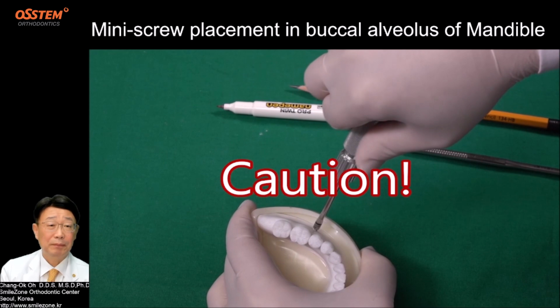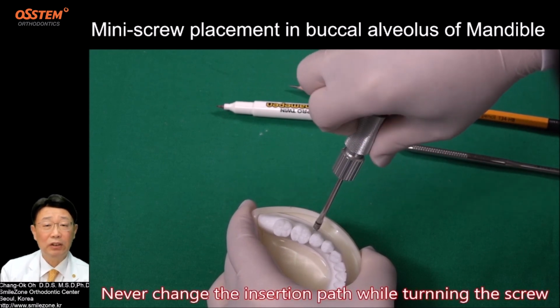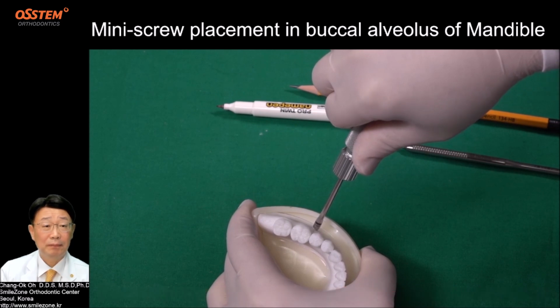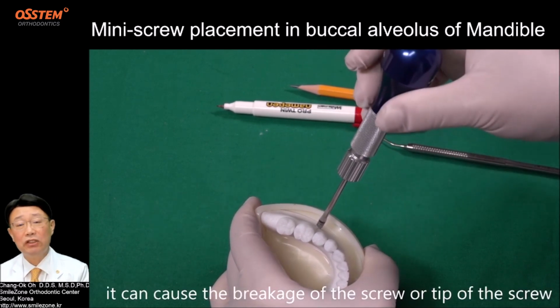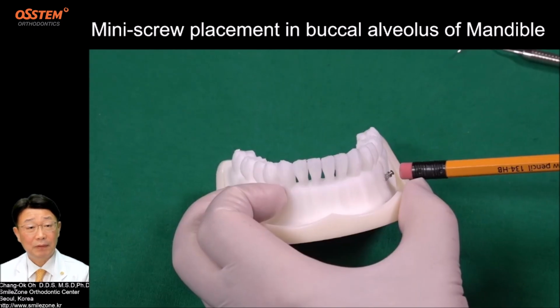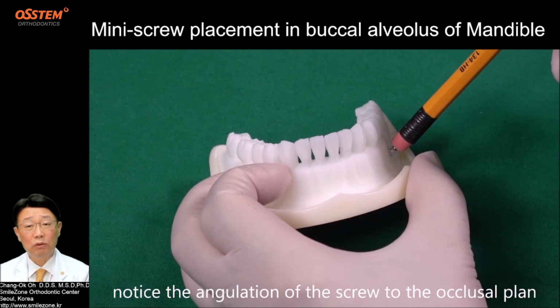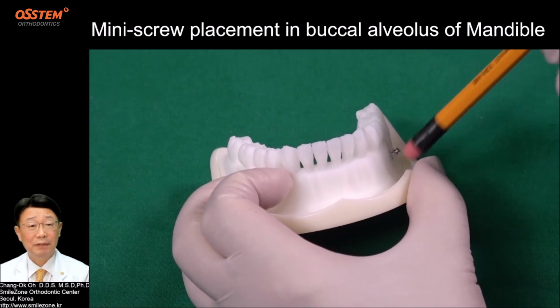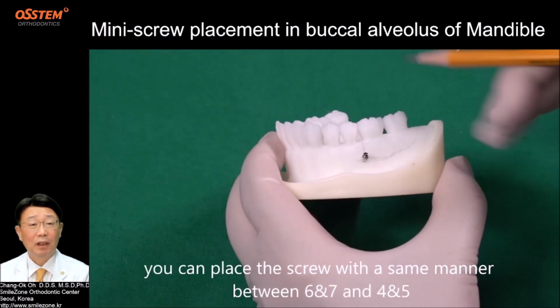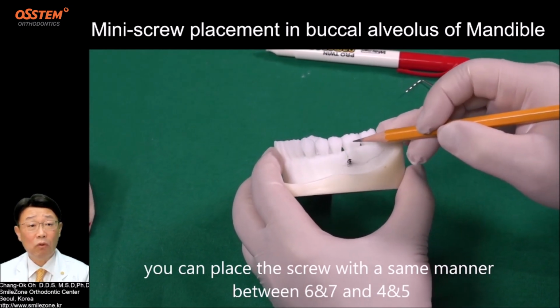Caution! Never change the insertion path while turning the screw. It can cause the breakage of the screw or tip of the screw. Notice the angulation of the screw to the occlusal plane. You can place the screw in the same manner between 6 and 7 and 4 and 5.